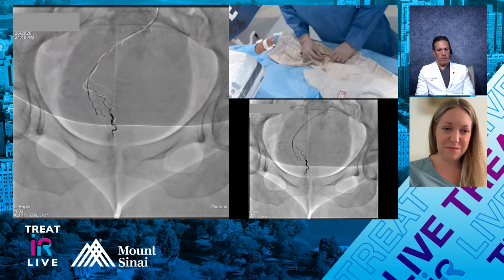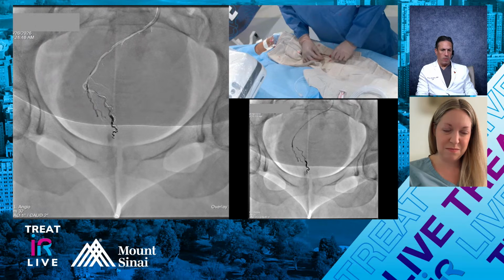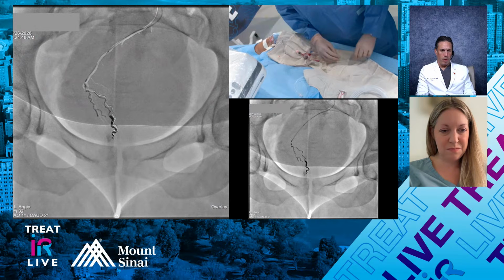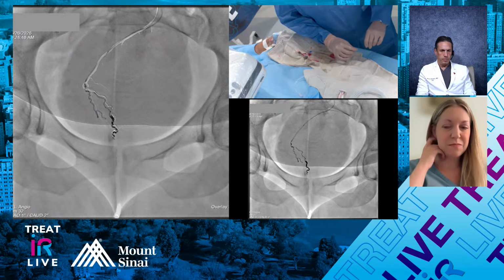Beautiful. Dan, you want to talk a little bit about our X-ray equipment in this room? Because I'm looking at the images right now, and the coils look amazing. The runs look great. This is our new Siemens Icono room over on the west side, and we both have a lot of great cases that we've done in there. What's your experience been doing hemorrhoids and knees over there?